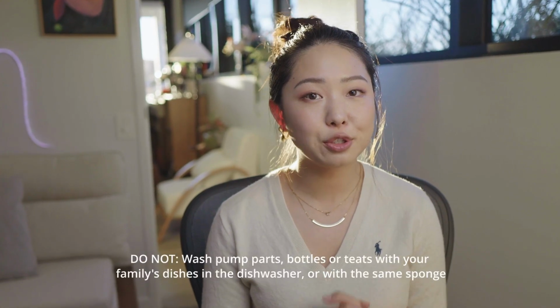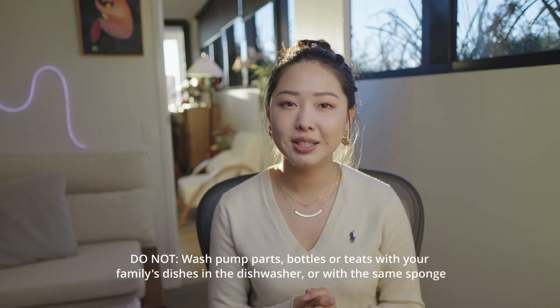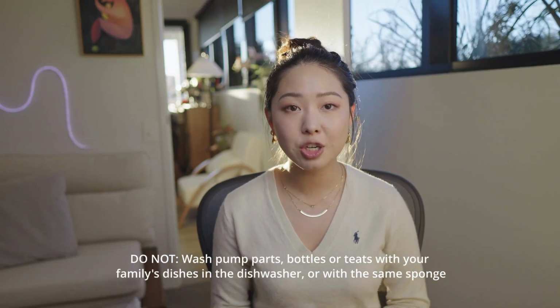It's really not that hard to wash pump parts. You just wash them like you wash your dishes, but make sure you don't wash them in your dishwasher with your other dishes, and ideally use a separate dishwashing sponge. When you're washing bottles, make sure you have a bristle brush so you can really get into the crevices of the bottles and clean them properly.